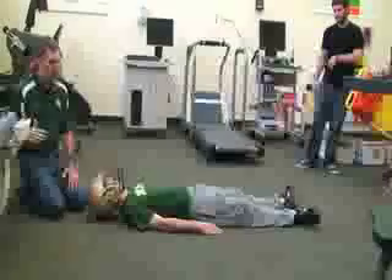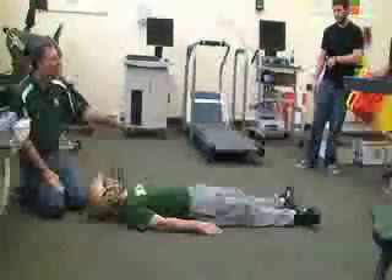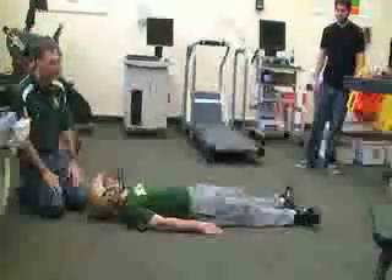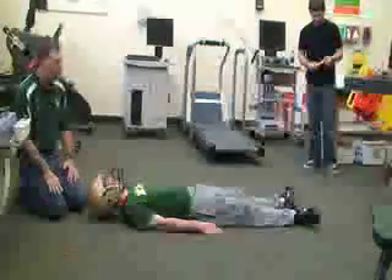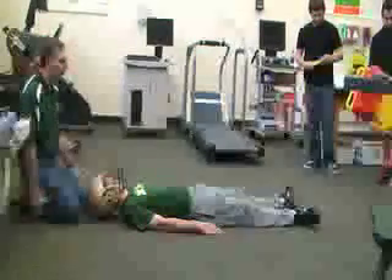With this one, if I determine that I need the cervical spine board, then I'm going to call my two rescuers out — one's going to have the backboard with them and another piece of equipment. You might also have some face mask removers with them.